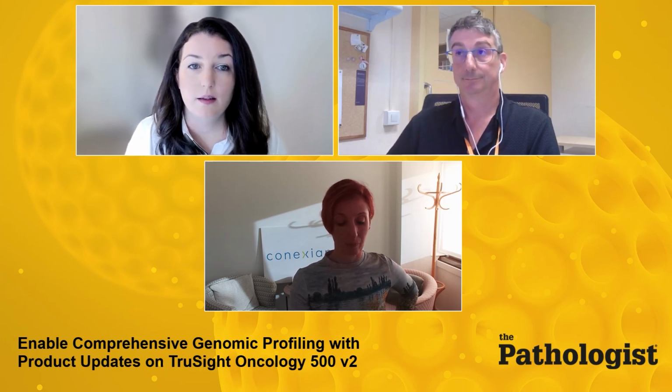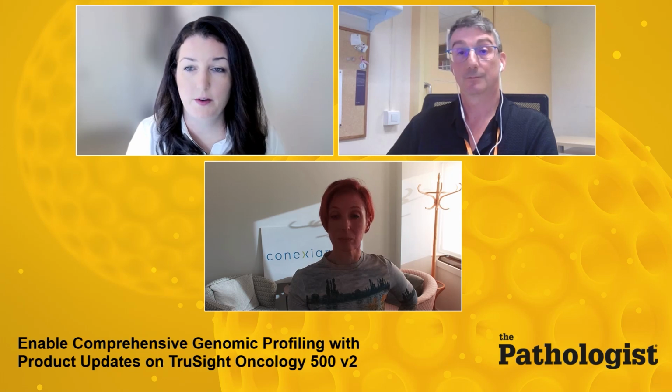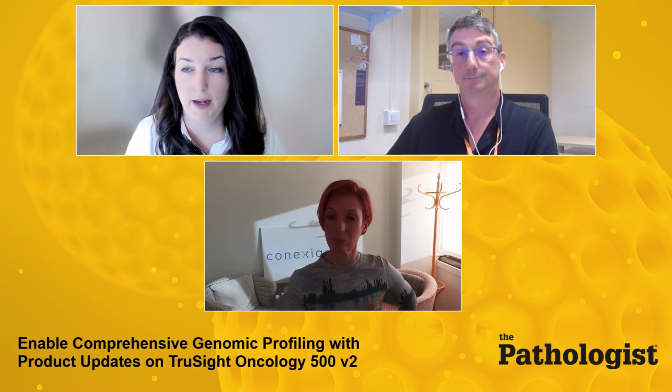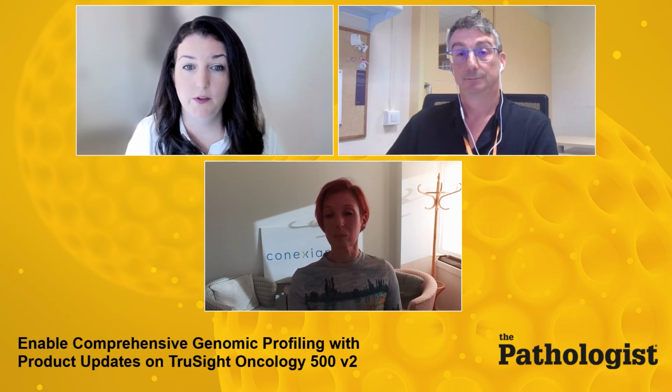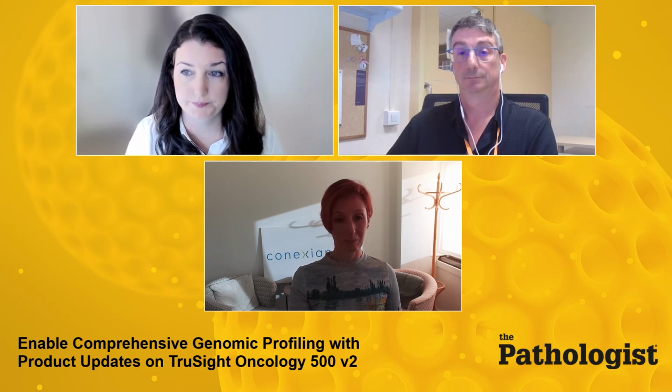Heather, do you want to address that one? Yeah, so the V2 product does call MSI, so that is an output of the analysis. If you'd like to use that for breast cancer samples, that is a use case for TSO 500.